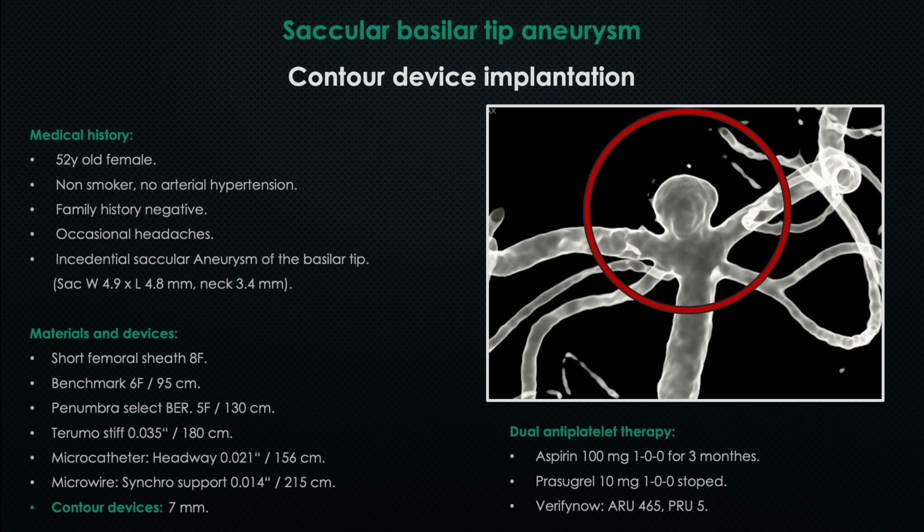Hello, dear colleagues. My name is Al Muhammad, and today we have a saccular basilar tip aneurysm, which we've treated with an intrasaccular flow disruptor contour device.